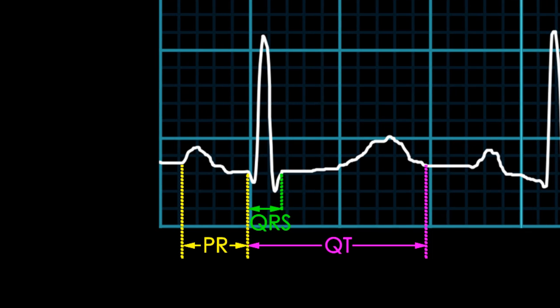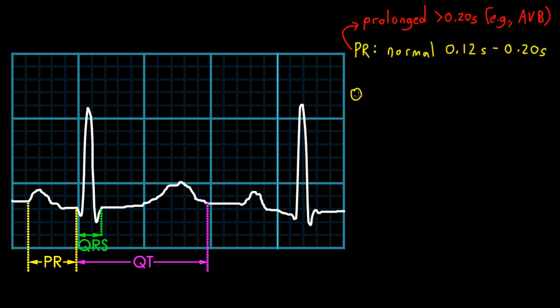The QRS duration represents the amount of time it takes for the ventricles to fully depolarize. It's measured from the start of the QRS complex to the end of the QRS complex. A normal QRS duration is typically less than 0.1 seconds or two and a half small boxes.